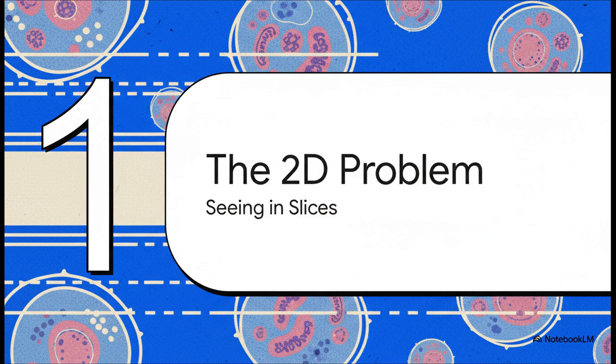And this really gets to the heart of what we can call the 2D problem. Scientists get these amazing, super detailed 2D images, but the slices themselves are often separated by these huge gaps. We're talking 100 micrometers apart sometimes. At the cellular level, that's like a whole continent of missing information.